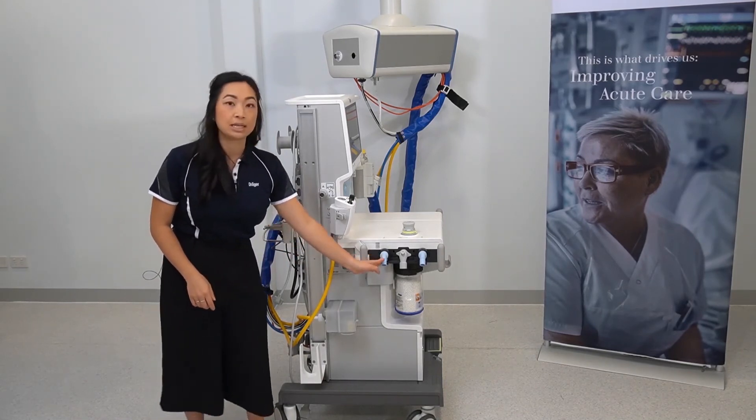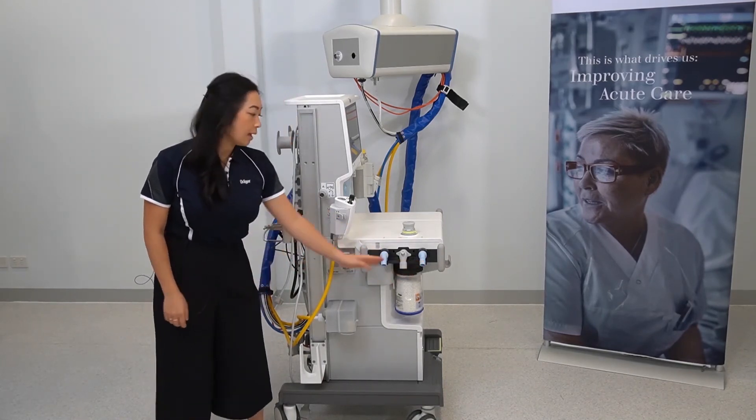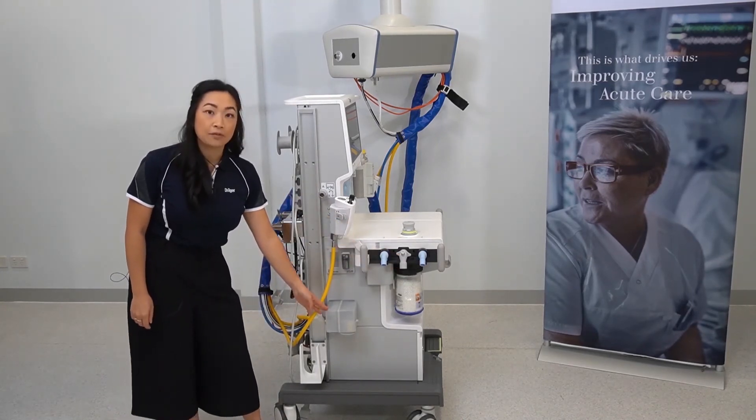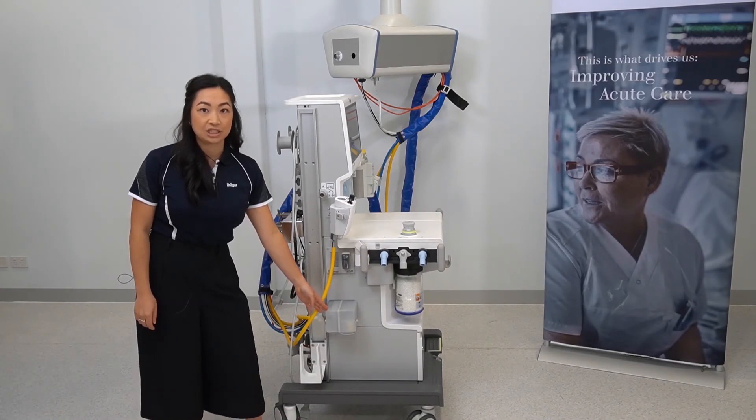As mentioned before, this is your inspiratory and expiratory port and your port for your bag limb. This is a side view of the anaesthetic gas scavenging system.